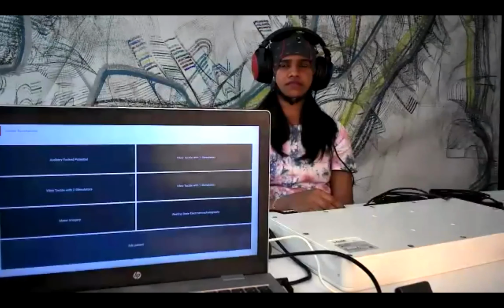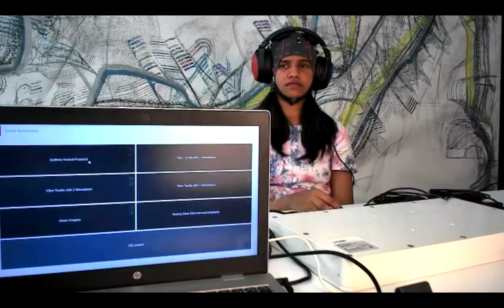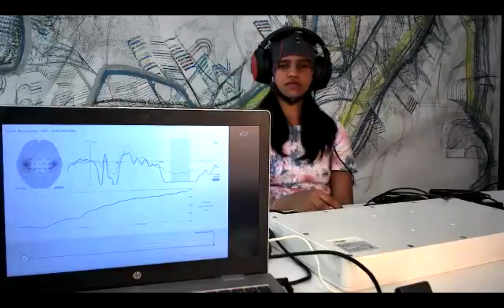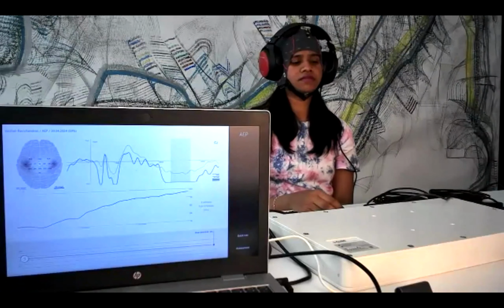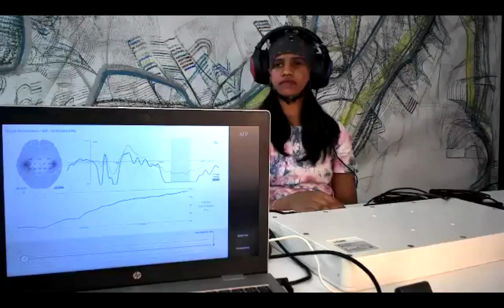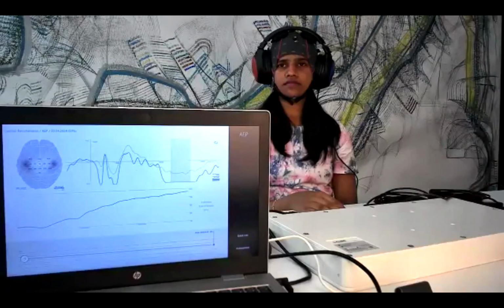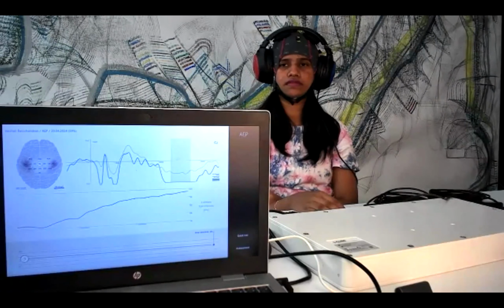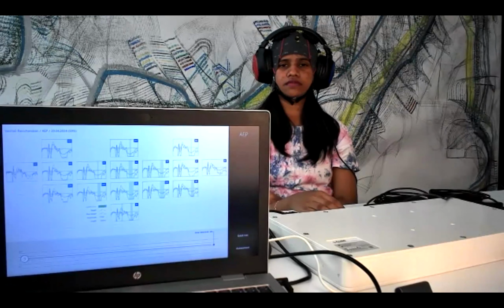So all this data will be saved, and I can go to the EEG paradigm again and check the results here. So for example, here it shows the amplitude. Here CPZ has an amplitude of 3.8 microvolt, and C5 has 7 microvolt. And from the EPs, we can see there's a significant area in the ERP between the target and non-targets. We can also take a look at all channels. So you can see it's basically consistent on most of the midline channels.